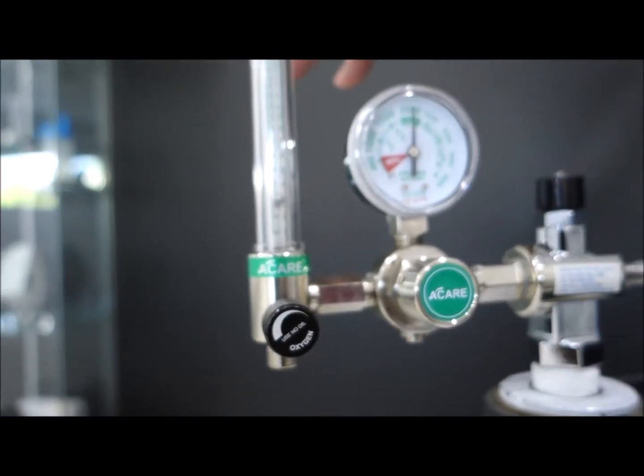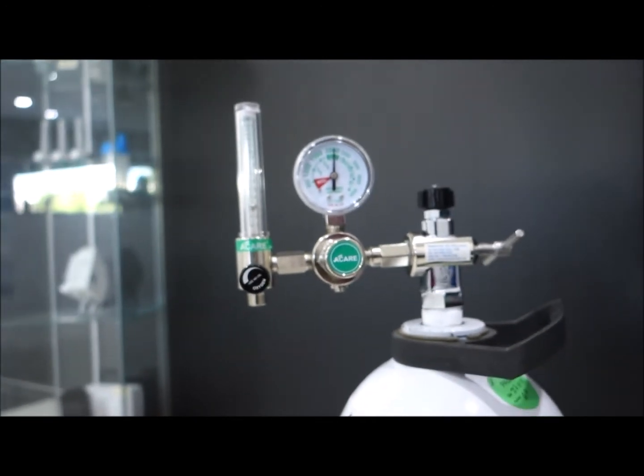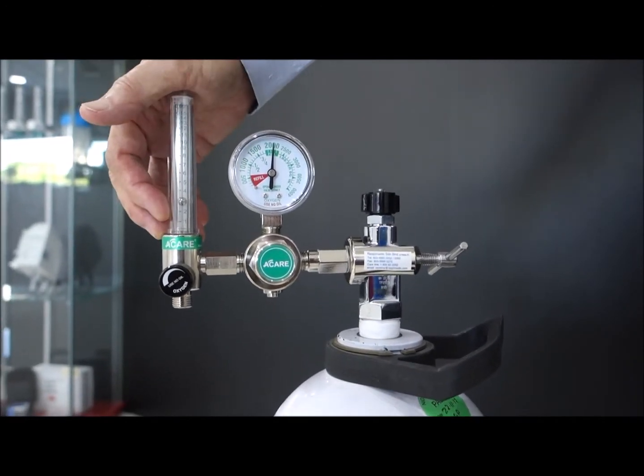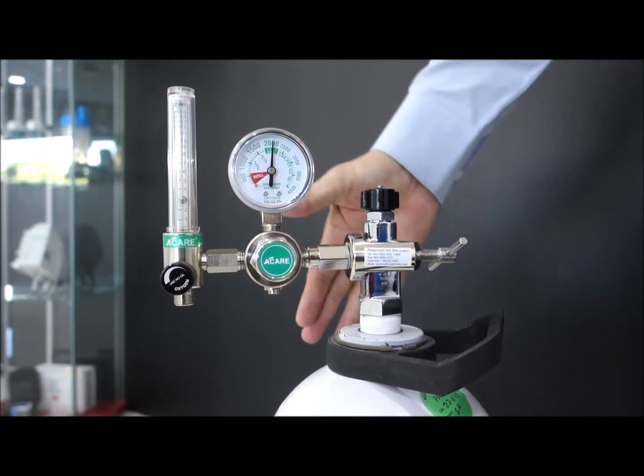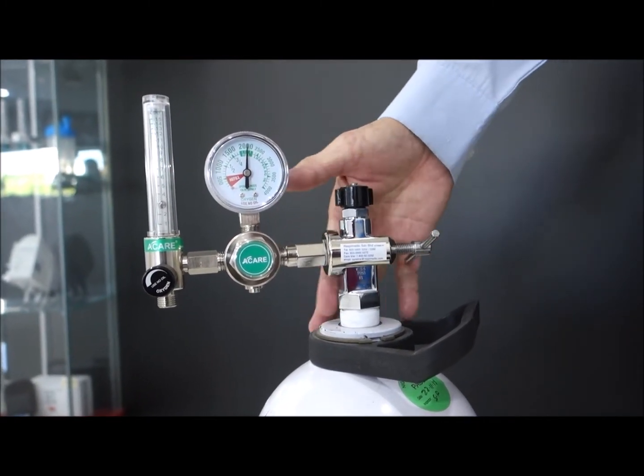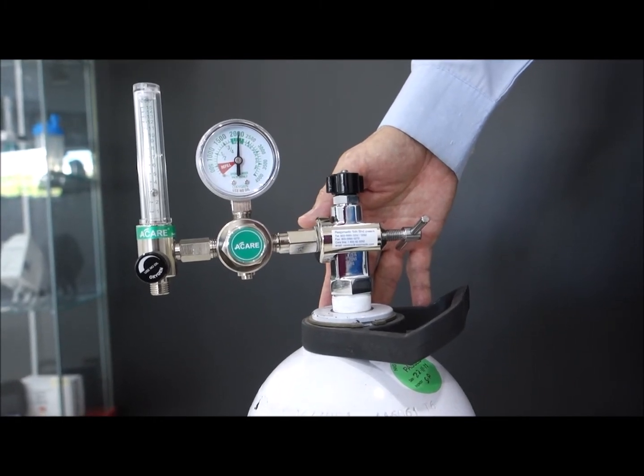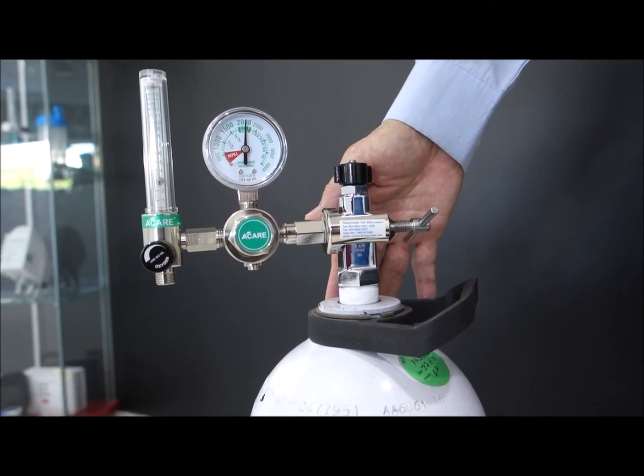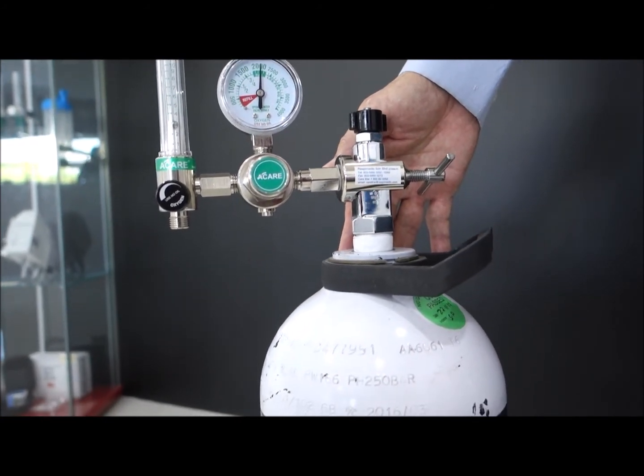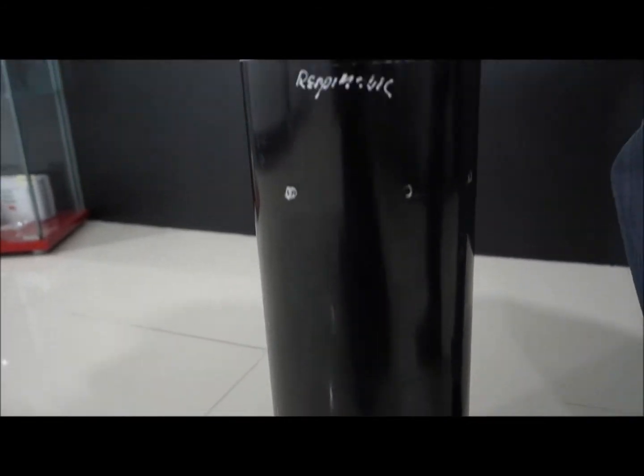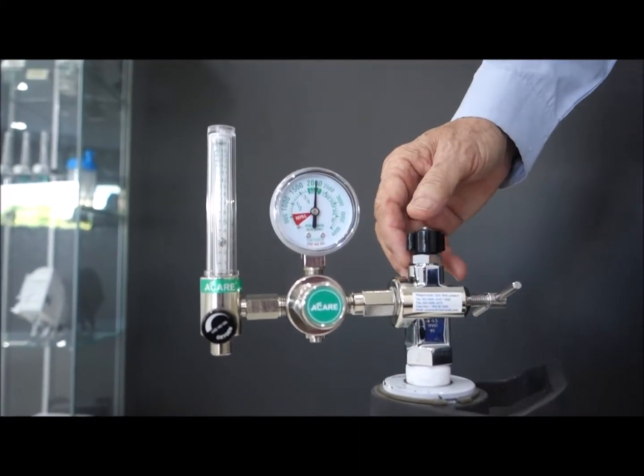Remember, the flow meter is calibrated at liters per minute. Meaning that, if you set at 1 liter, theoretically, you'll be able to draw out from the 1,400 liters capacity, about 1,400 minutes of use. About 1,400 minutes, round about, give or take about 10%, to account for some leakages in the system.